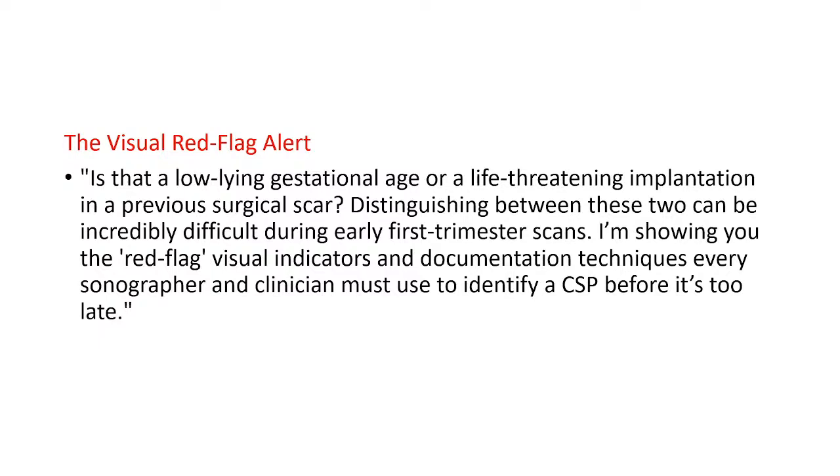Distinguishing between these two can be very difficult during early first trimester scans. I'm showing you the red flag visual indicators and documenting techniques every sonographer and clinician must use to identify a cesarean scar ectopic pregnancy before it's too late.